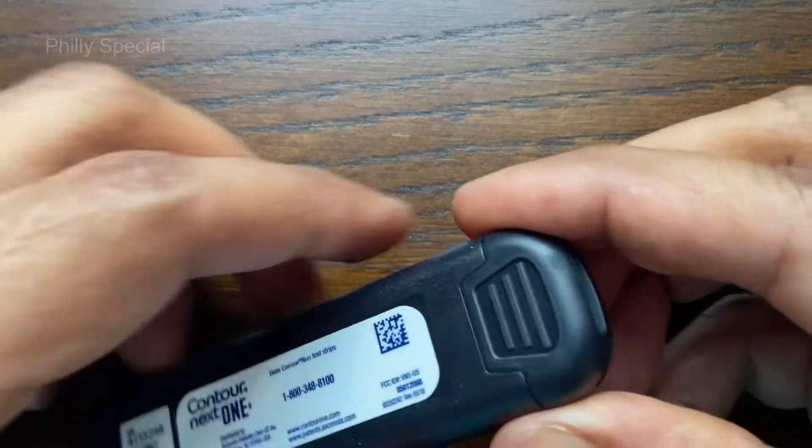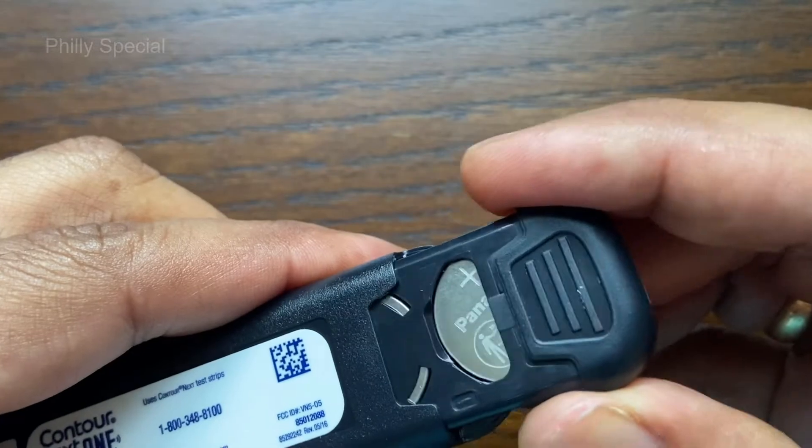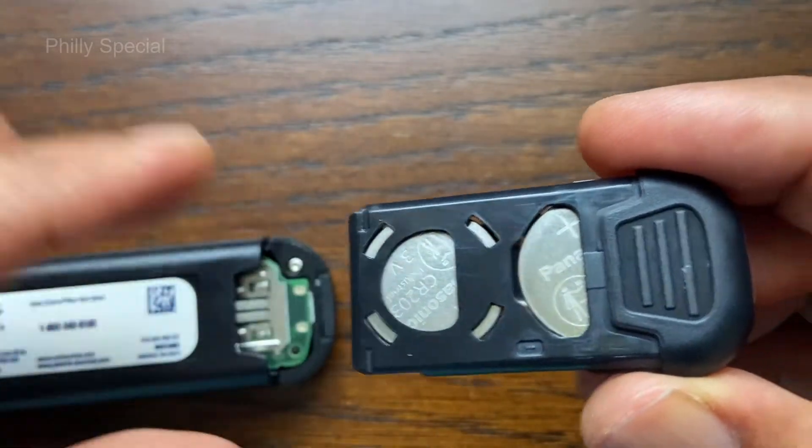Before replacing the batteries, turn off the meter. Turn the meter over and slide the back cover in the direction of the arrow. The battery holder comes out.